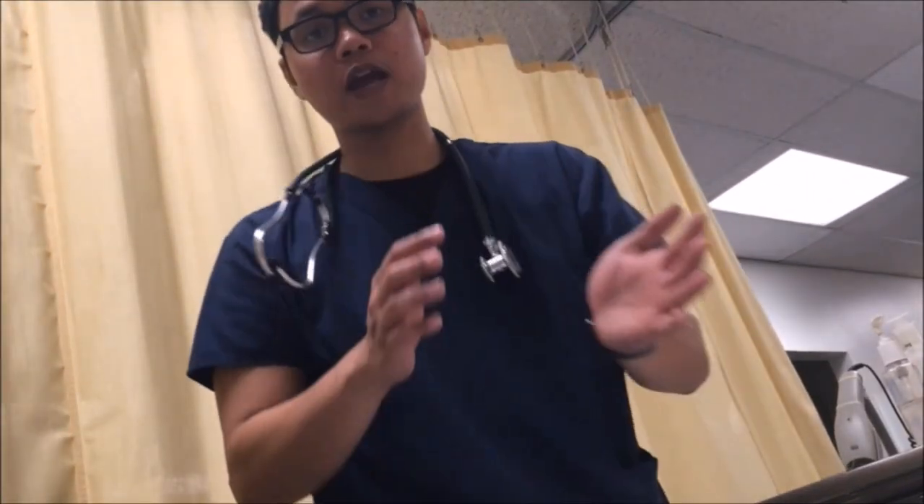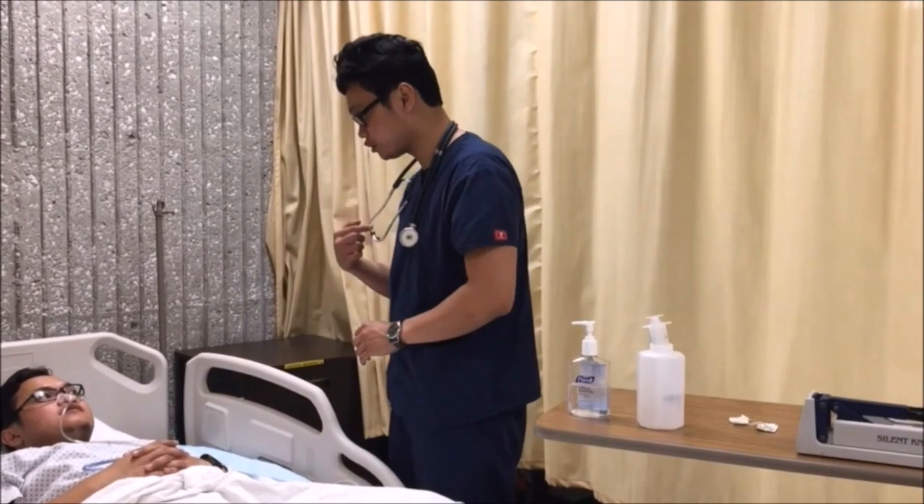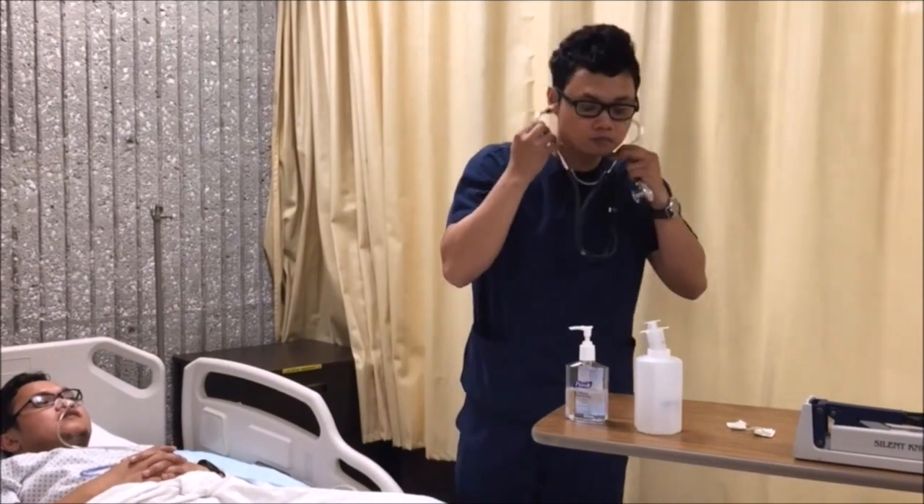Alright, very good. So tonight I will be giving you your medications. But before that, I have to check the placement of your NG tube. Sure, alright.